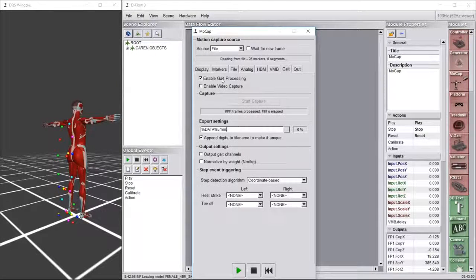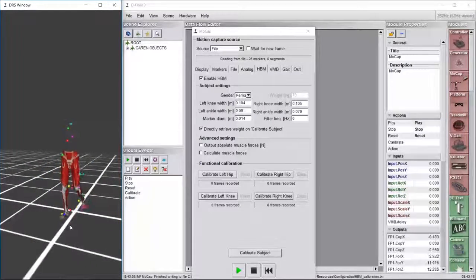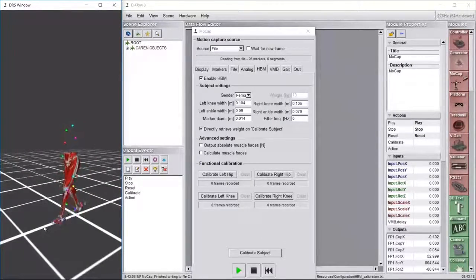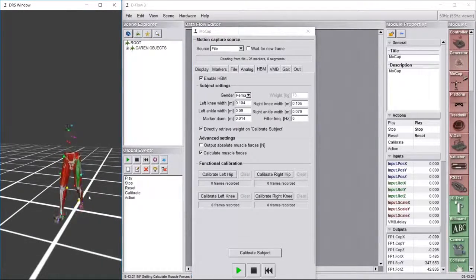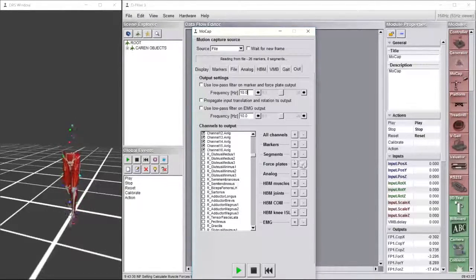And now at this time, you will see the model be connected to the markers. And now the real-time solution is actually running. And we'll see muscle forces visualized as colors. There you go. You'll see some green. That means the muscles are active. And now what you will see is some real-time graphing. Okay, first, yeah, let's look at the outputs.